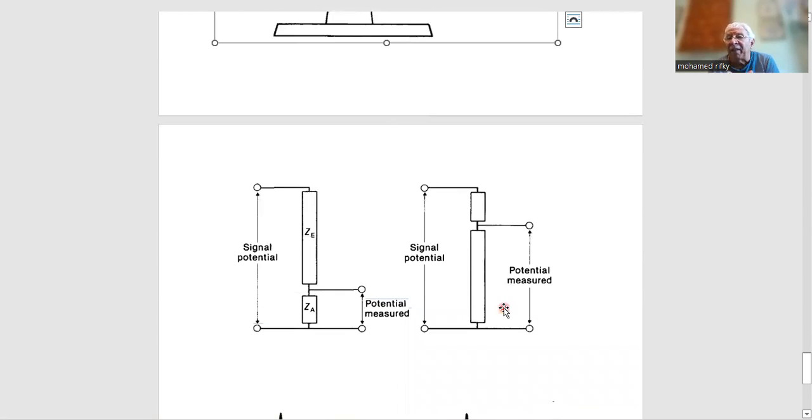This is the meaning of impedance. Impedance is a type of resistance, but it is correlated to the frequency. You see, the symbol of it is Z. So we have an impedance of the ECG and the skin, and of course of the equipment. We call it Z equipment. So we have two impedances. Whenever I'm using a device such as ECG, it's better, of course, to have a high impedance in such circumstances to diminish the attenuation of the signal.